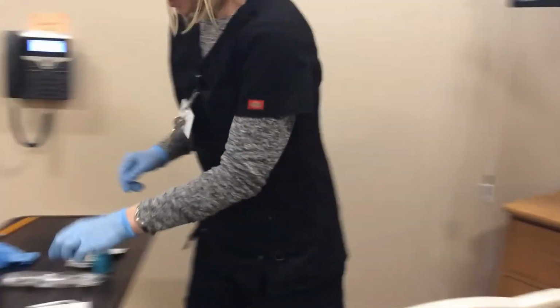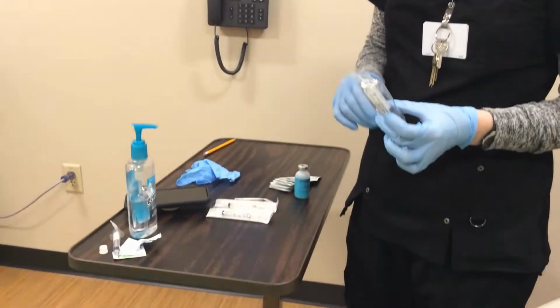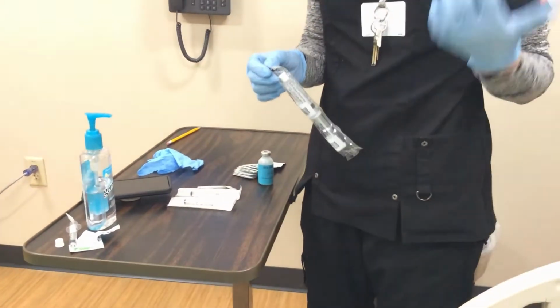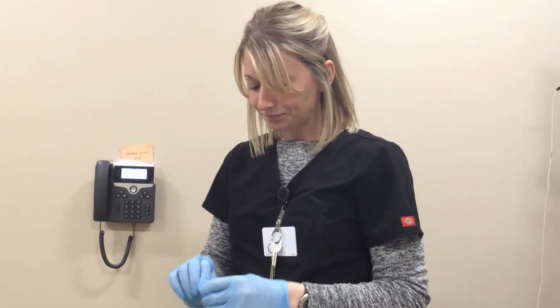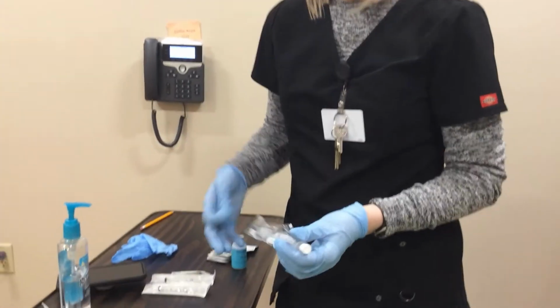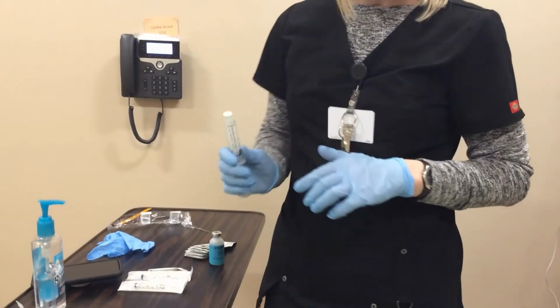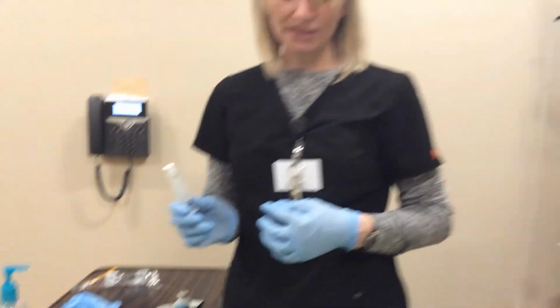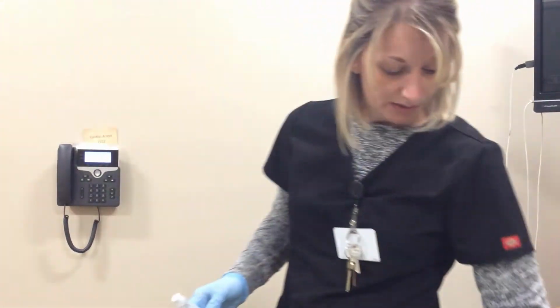So if it's not compatible, depending on the facility that you work in, they may say 3 to 5 mLs of saline is needed to buffer your solution. So follow the policy of the facility that you are working in. But for my purpose, I'll just say I looked at my policy and they said I need to use 5 mLs of saline to buffer.